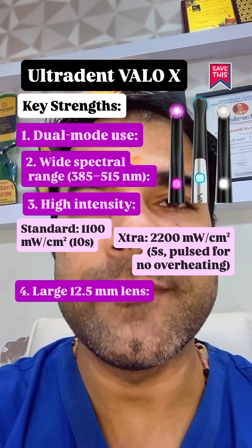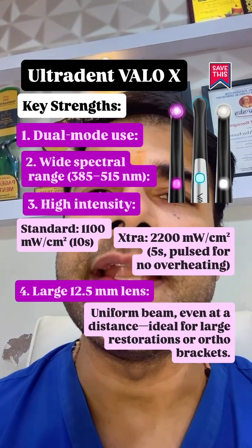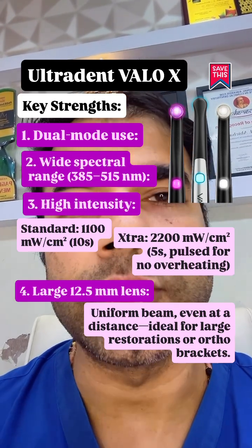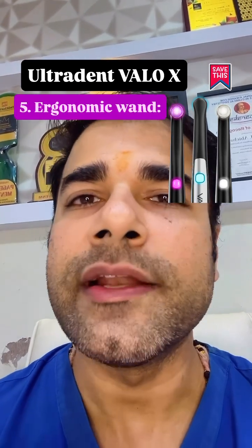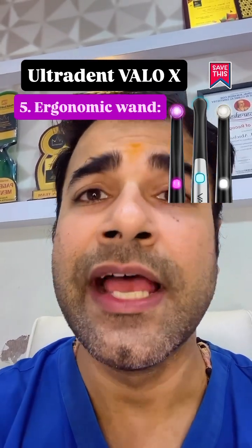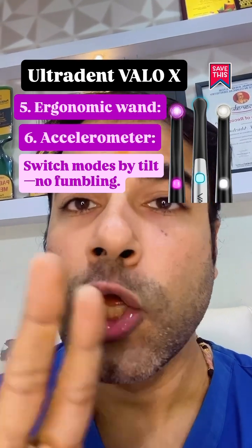Large 12.5 mm lens provides a uniform beam even at a distance, ideal for large restorations or orthodontic brackets. The ergonomic wand's slim profile reaches distant molars with ease, and an accelerometer switches modes by tilt — no fumbling.